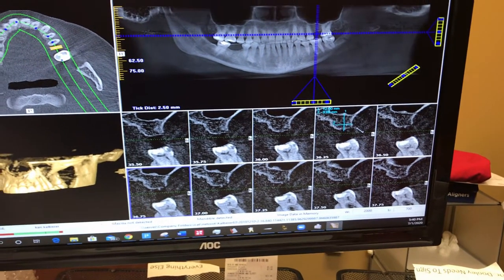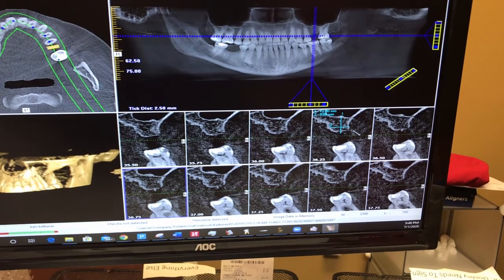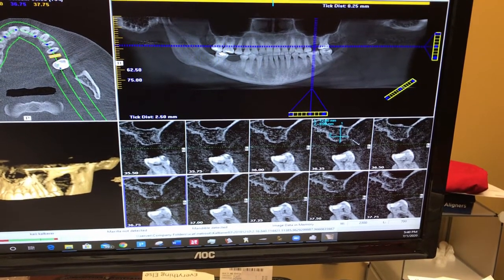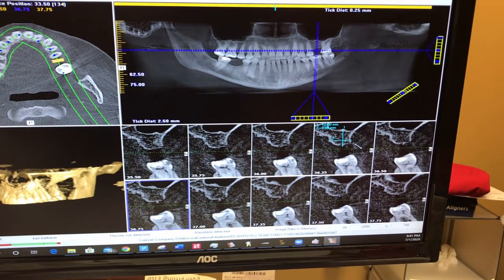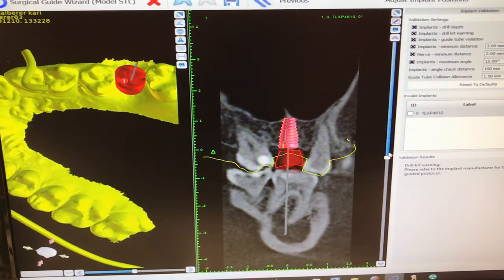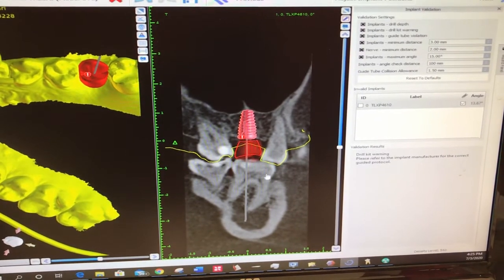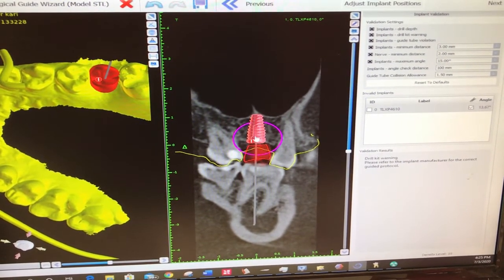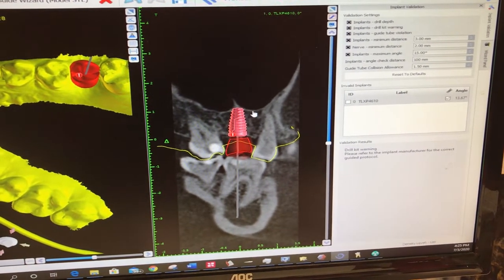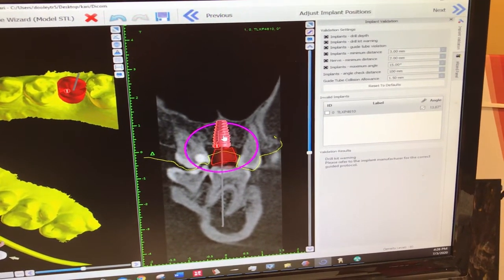We use the technology to measure out what size implant will be perfect for our patient. Taking it a step further, we combine the 3D x-ray with the intraoral scan to digitally plan where the implant will go. We merge everything in our computer software and digitally plan the implant so it comes right down the middle of the tooth, right next to the sinus but not into it — you can move it every which way to get it into the perfect position.